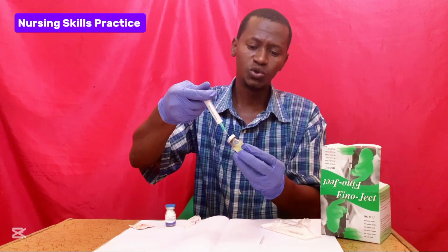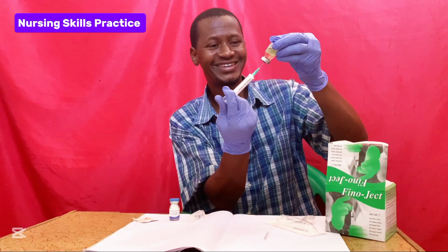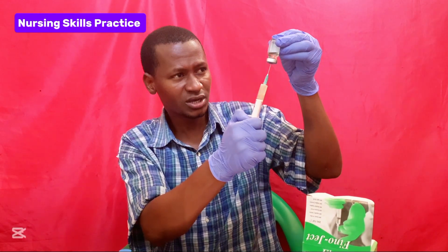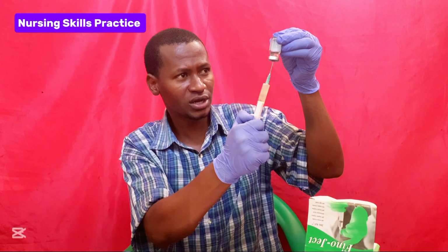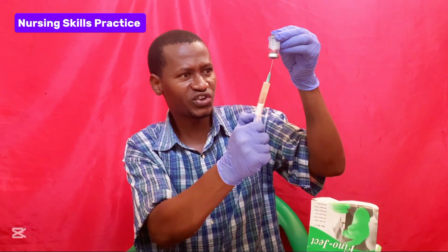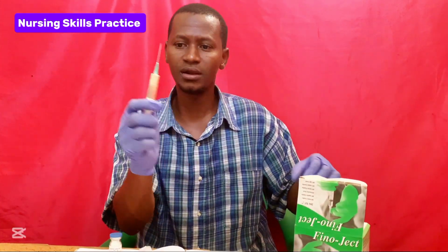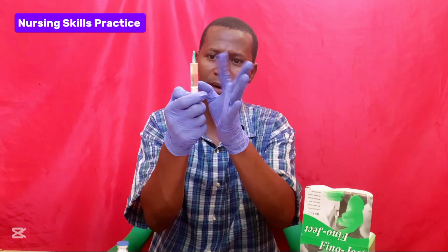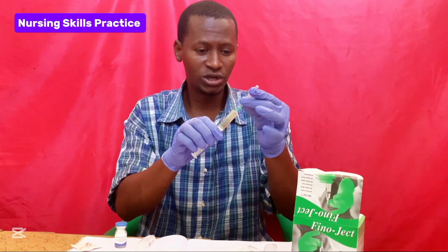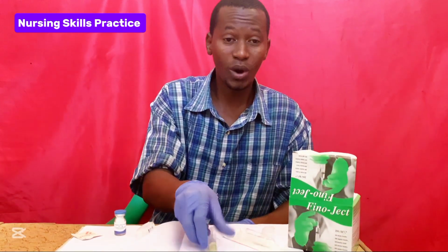Then hold the vial horizontally so that you can withdraw the drug from the vial. Make sure you keep the needle in line with the liquid to avoid air bubbles rushing into the syringe, so that you can withdraw all the drug. When you finish, remove the needle from the vial. Then remove any air bubble, put back the cap of the needle to avoid contamination or injury, and place it on the working bench.